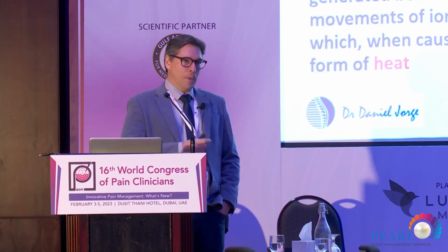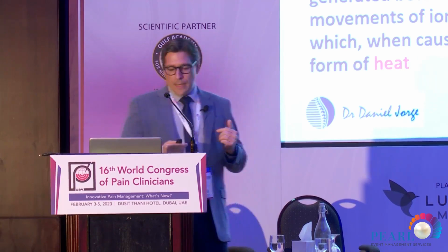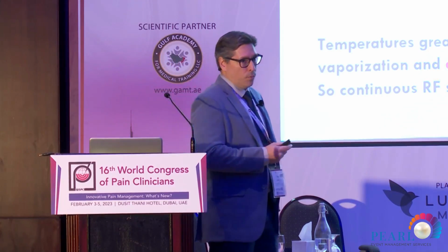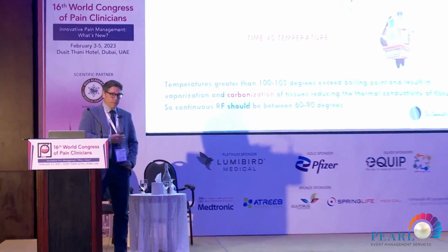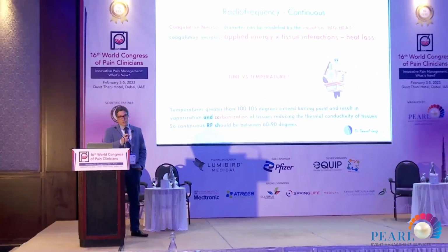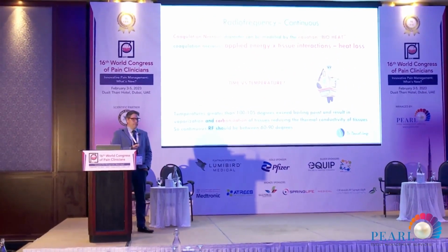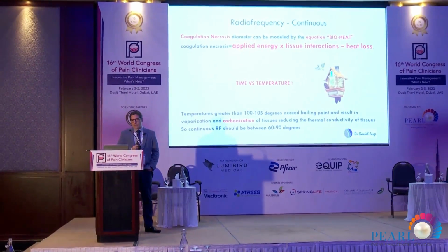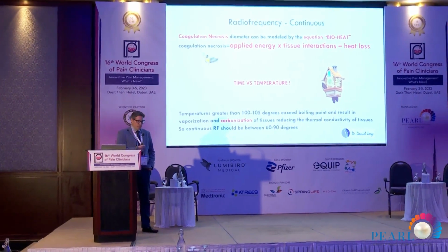When we are talking about the continuous radio frequency, the ablative one, we are talking about inhibition of pain using heat. We know that the heat will promote coagulation necrosis in that area. And we can measure the diameter of that lesion with the bioheat equation, and we can act on that equation as well.